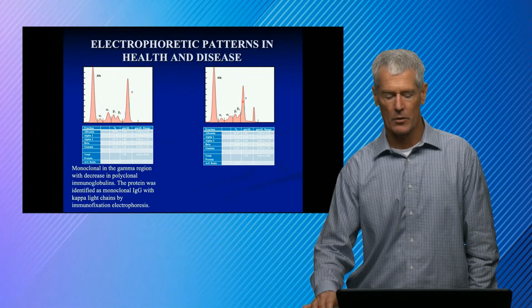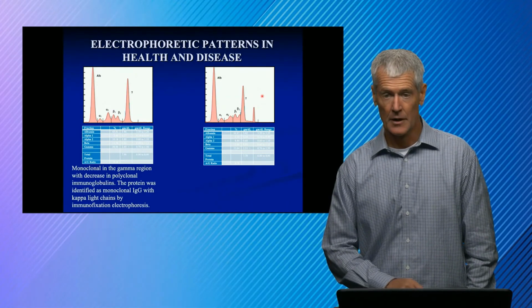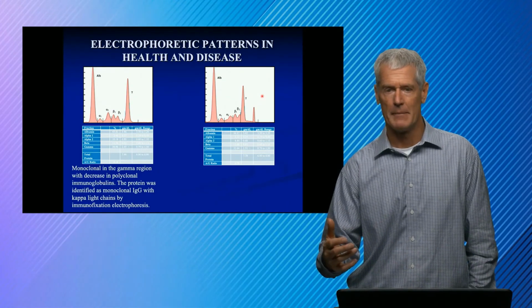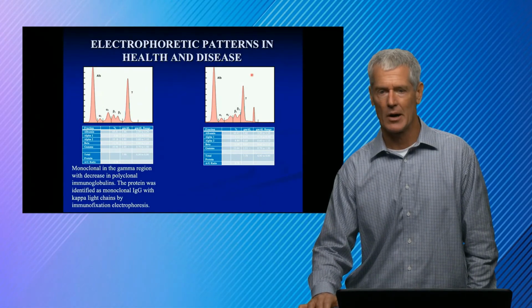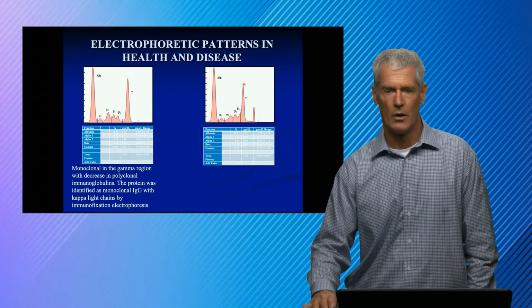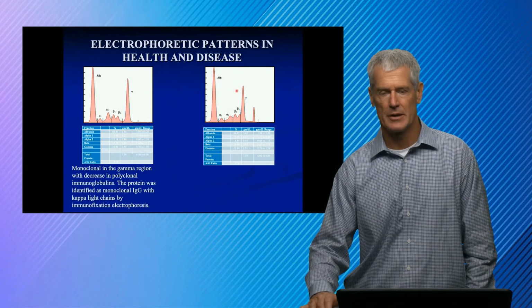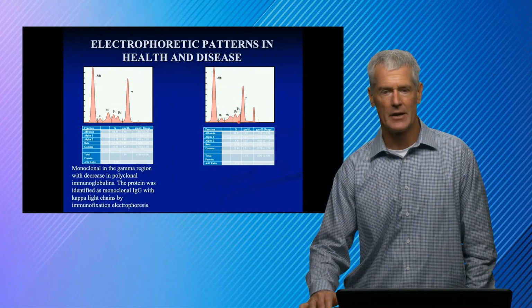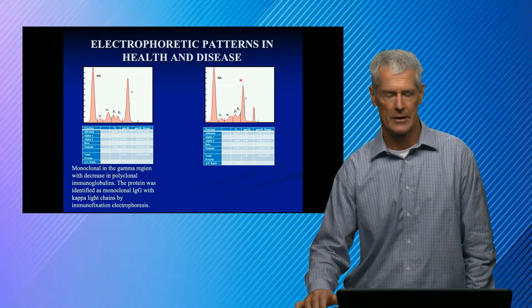This is a little bit more rare case. So we have a monoclonal protein here, and we have a monoclonal protein here. This would be, instead of being monoclonal, a biclonal, and typically it has about the same prognosis. Essentially, you got multiple myeloma twice, and that is one explanation, and really you would have to do an IFE to figure that out and show that these were two different monoclonal proteins.